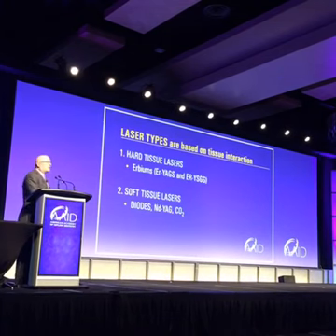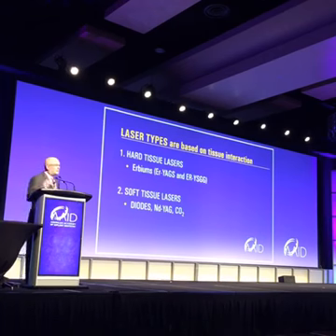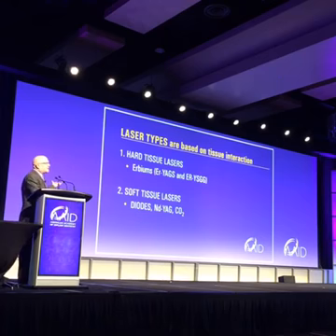Laser types are based on where they interact. And this is really important. There are hard tissue lasers, they're mostly the erbiums, the erbium YAGs, the erbium YSGGs. And the soft tissue lasers are basically the Nd:YAGs, the diodes, the CO2s. Now, erbiums will do soft tissue work, but they're mostly developed for hard tissue, treating teeth, etc.